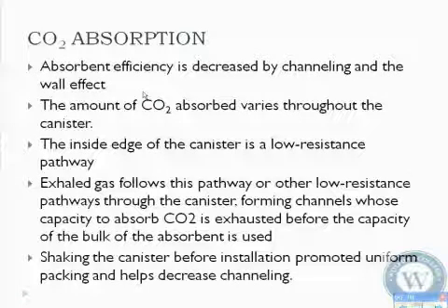All right, we've talked about the channeling. Channeling effect is when there's preferential movement of air through the CO2. So it's going to exhaust just certain channels around the CO2 canister rather than from top to bottom equally. All right, we want equal spread. That's why they now try to prevent that, and you need to shake it. Okay. The inside edge of the canister is a lower resistance. So around the actual walls is a lower resistance. That's why they have to put the annular rings in.